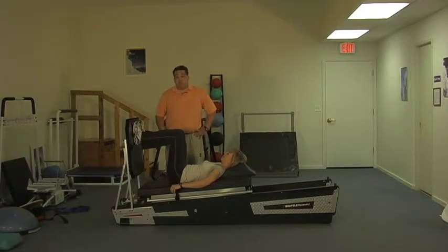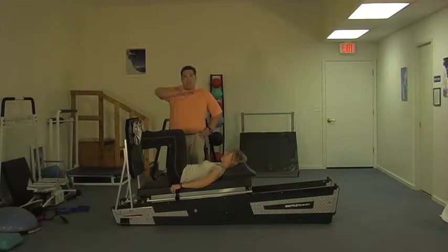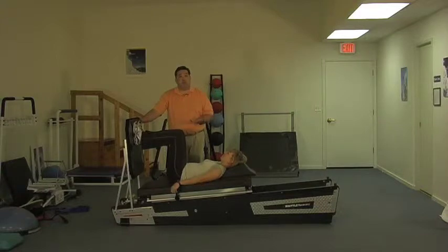A couple things to point out while we were off screen: we took away that shim from under the base of the shuttle recovery. What that does is it changes the angle just slightly — still very comfortable for the patient. Obviously you can't do that while the patient is on, but it's a pretty easy one-person technique if you're watching ergonomics. That means we can have all the elastic resistance but also get that incline plane, so it's a great way for your athletes to really load things up or work some eccentrics.